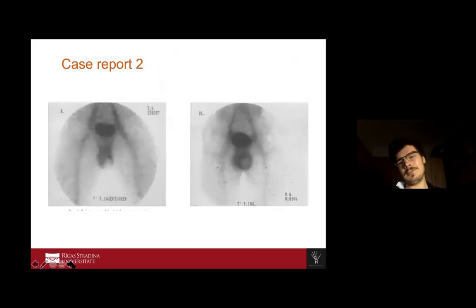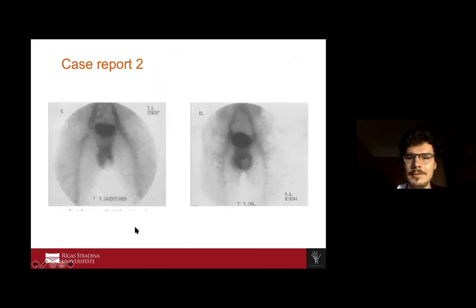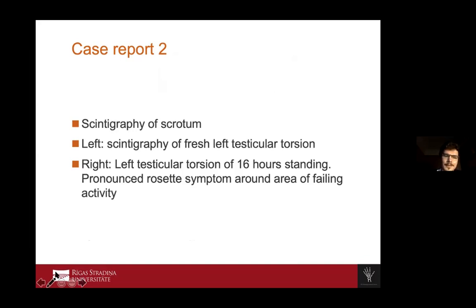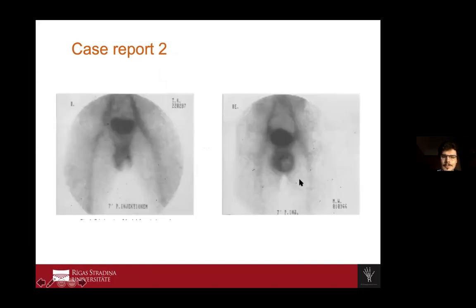Case 2: This is scintigraphy of the scrotum. In both images of the scrotum, there was a testicular torsion — two different cases, but always the left scrotum. We see a negative picture because, due to the torsion, there is no tracer in the left scrotum. We also see a slight spot on the left scrotum in the second case.